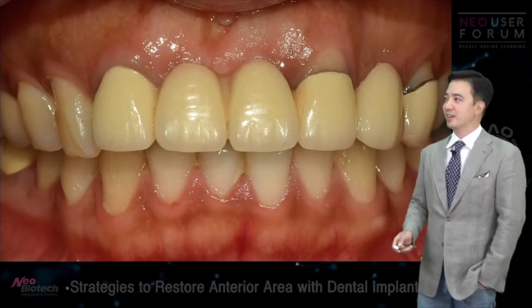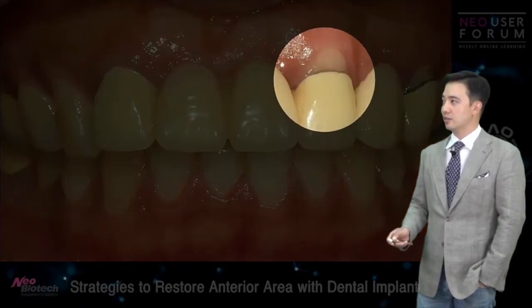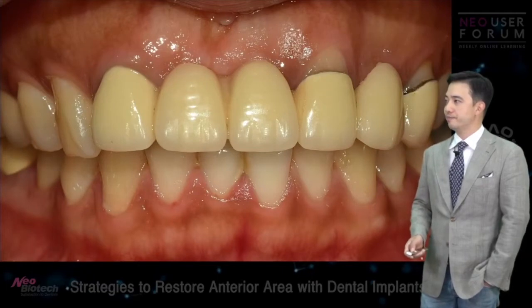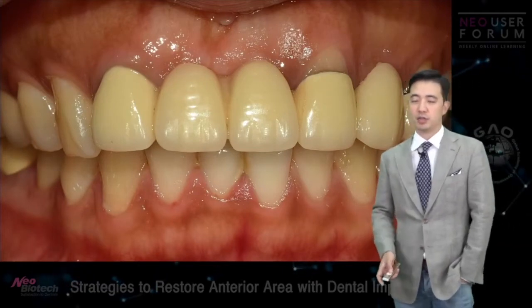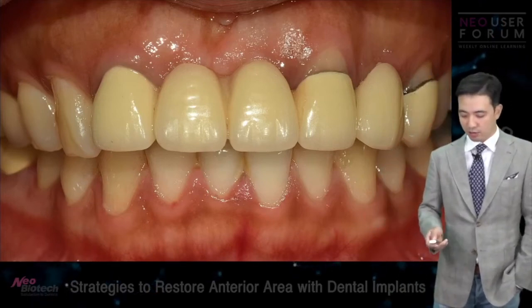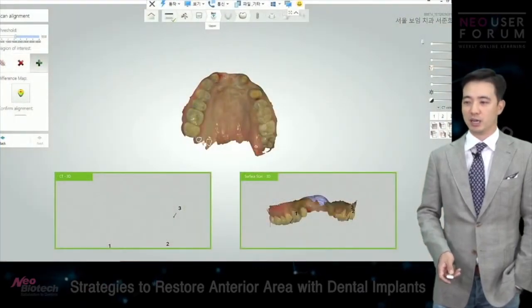And as you look here, there's a marked recession on the number 22 area. I thought I already knew this was gonna be a challenge, but I just took the bullet and said, okay, let's do this. I'll try my best, and we can make this happen.